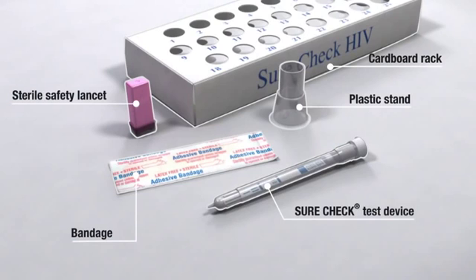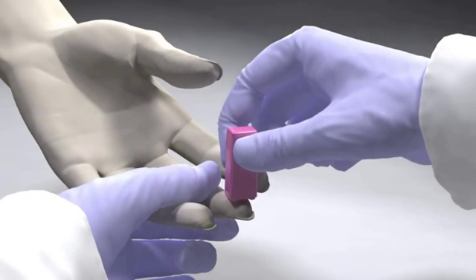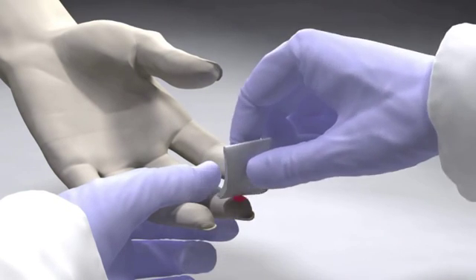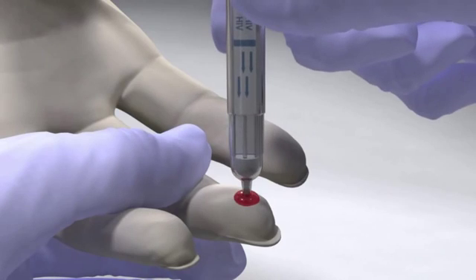Remove the SureCheck HIV-1 and 2 device from the foil pouch. Obtain a venous or fingertip blood sample according to your normal laboratory practices. If you're taking a sample from a fingertip, wipe away the first drop of blood after pricking the finger and sample from the second drop. Touch the tip of the SureCheck device to the drop of blood until the tip is filled with blood.